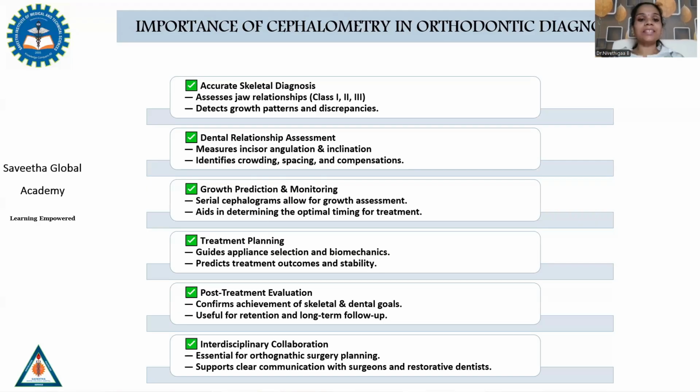It helps us in treatment planning. It provides a guide in appliance selection and biomechanics, and it predicts the treatment outcome and stability. Also, it provides details about post-treatment evaluation of the patient. It confirms the achievement of skeletal and dental goals.